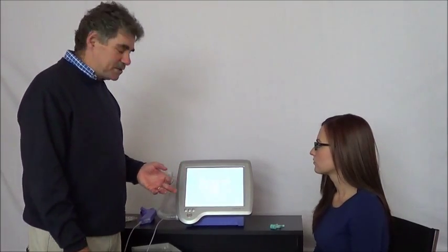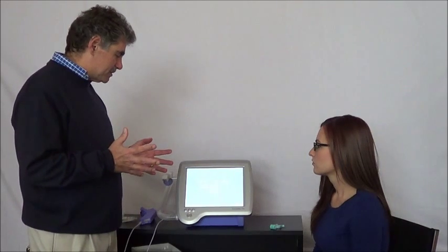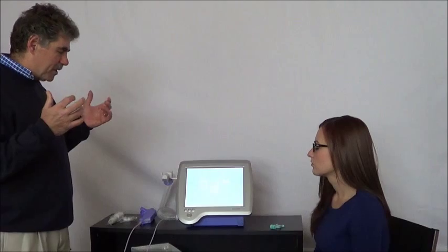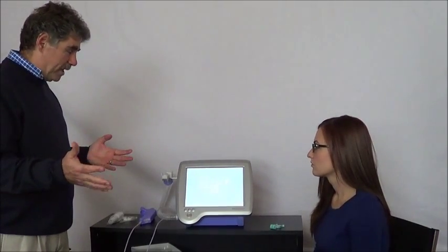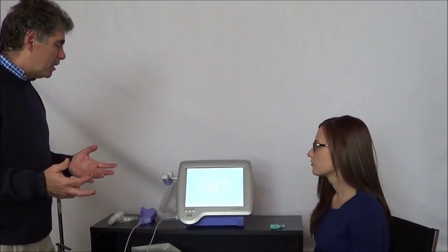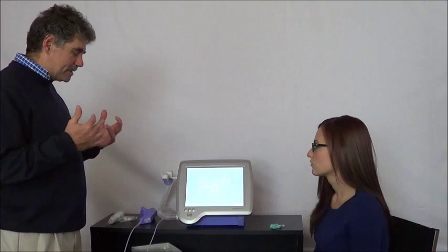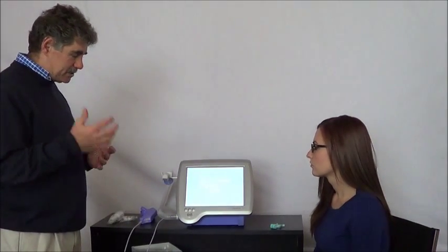Now we're going to do the slow vital capacity test. The slow vital capacity test is a test where we want you to fill your lungs completely and to exhale that air completely, but in a slow way. Unlike a forced maneuver, we don't need you to blast — we just need you to exhale that air completely, but at your own pace.